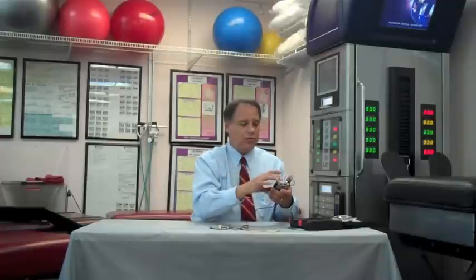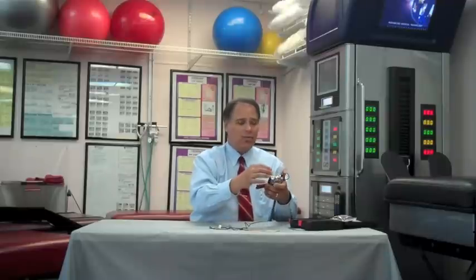And as you're feeling that electrical sensation, you would then leave it at that level, and as your body begins to acclimate or get used to the current, if the pain is not relieving sufficiently, you may increase the strength of the electrical current. If the device begins to not satisfy the pain or reduce the pain, you would then consult with your physical therapist and your doctor. And again, they may advise you to change the pulse rate and the pulse width.